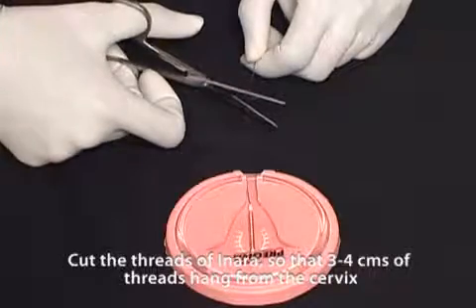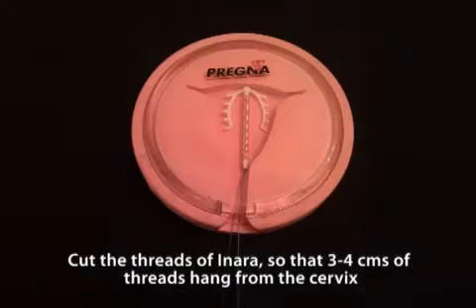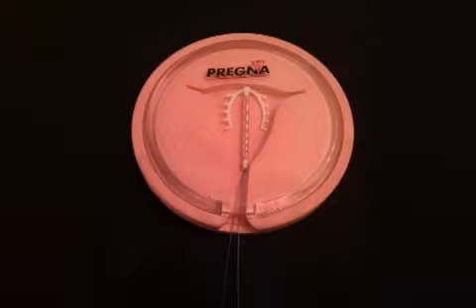Cut the threads of the inara so that 3–4 cm of threads hang from the cervix.